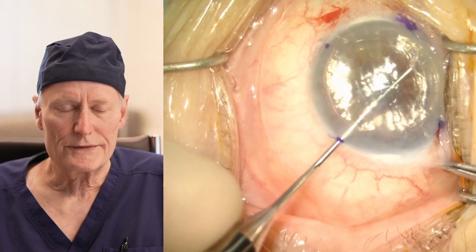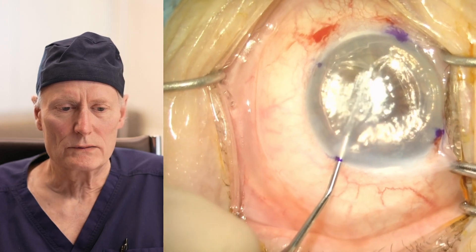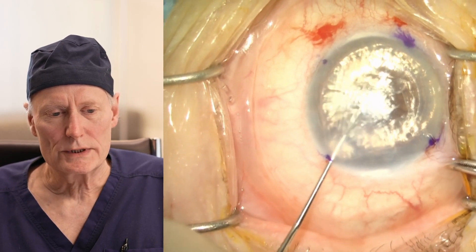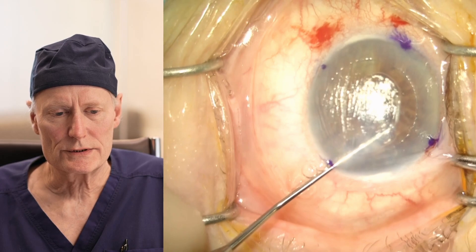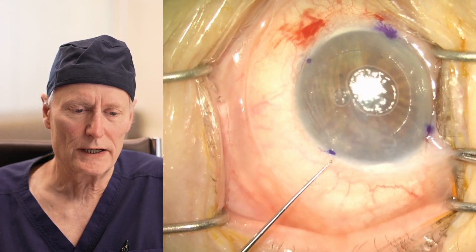Here we're peeling off the cells that have not been working. These are a layer of cells, and we can see it's kind of like peeling the cellophane off of a compact disc. We use the air and the surface tension it produces to get a nice little sheet of cells, and we can just remove them from one of these tiny little incisions that we've created.